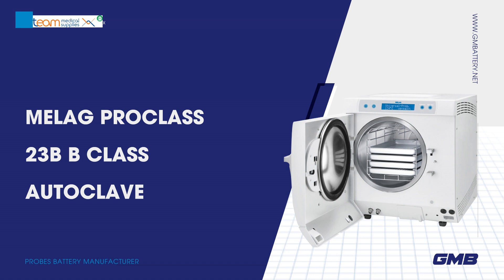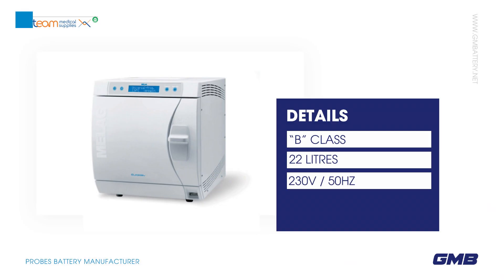Team Medical Supplies — Malag ProClass 23B, B-Class Autoclave. Details: B-Class, 22L, 230V / 50Hz.